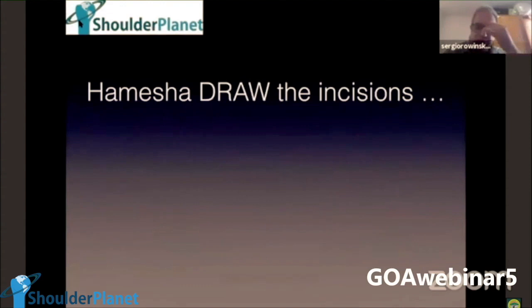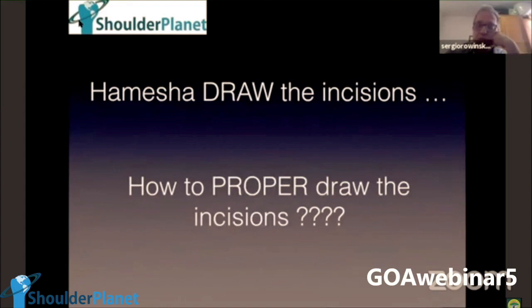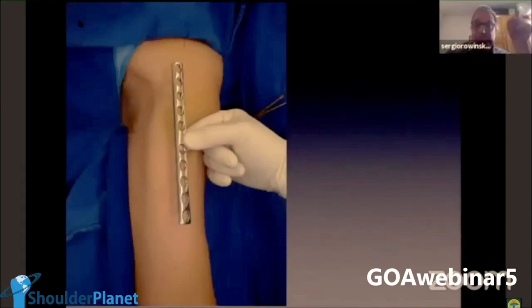So how am I going to draw the incisions? This is a very old picture, just for pedagogical purposes. This is a 10 hole, but for many years I only use 12. And what you must understand, you are looking at this and looking at the image intensifier all of the time with traction. I don't have this image, but imagine you have a reduced fracture in C-arm, just like this X-ray, with a very good reduction.